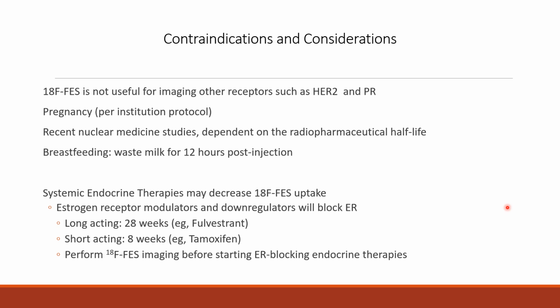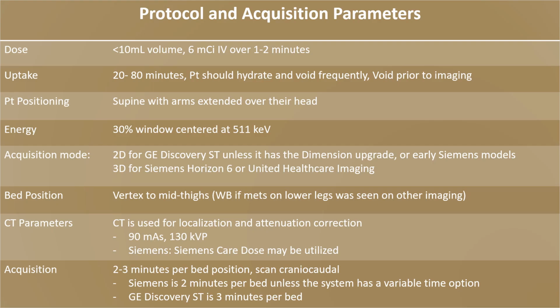You don't ever want to delay a patient's therapy to get their FES scan. So the correct protocol there is to do the fluoroestradiol study before they get started on those therapies. And then I think that's all I was going to say about that.